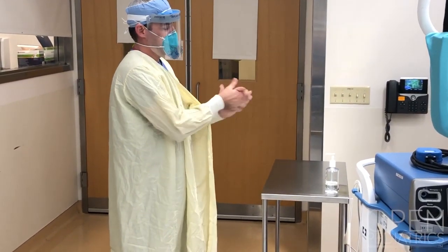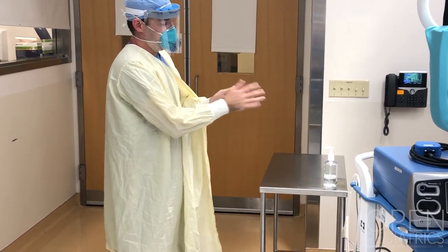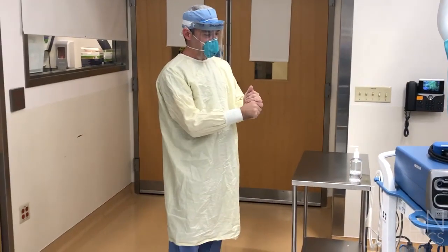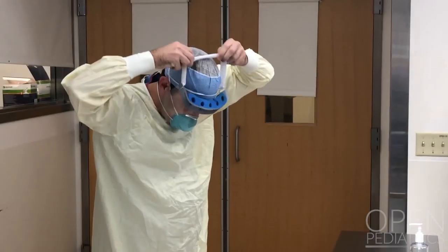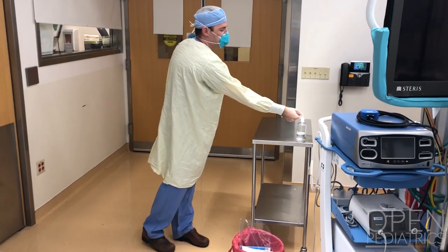Then perform hand hygiene. Rub your hands for at least 20 to 30 seconds until the alcohol rub is clear. Now remove your face shield by leaning forward and grasping the back elastic strap of the face shield, pulling up and away from your body, then immediately discard the face shield. Perform hand hygiene.